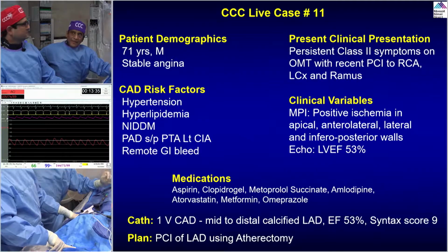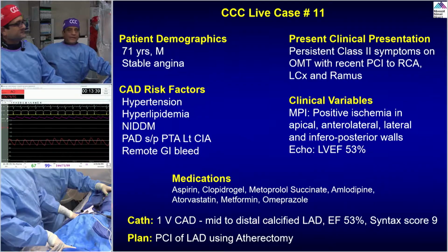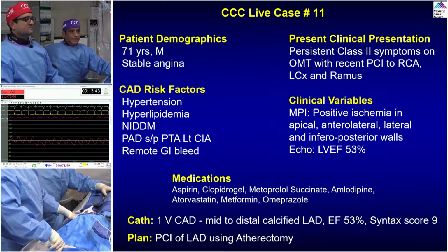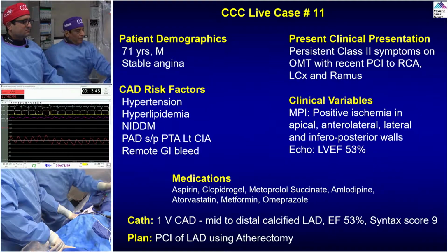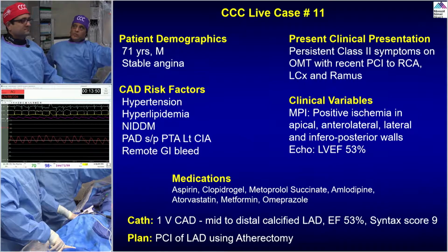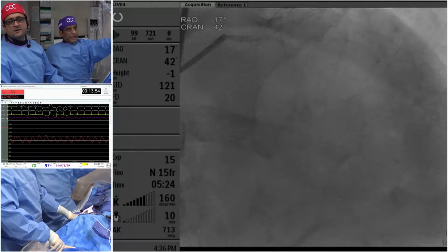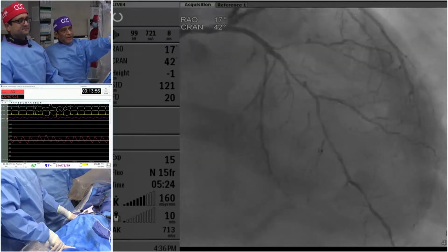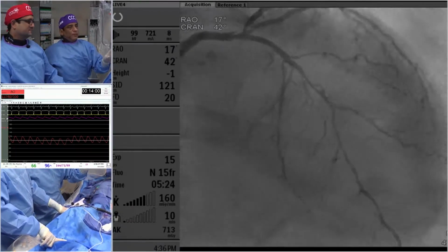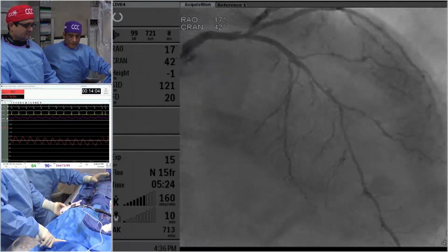There is always a little ulcer in the distal left main. We'll do the IVUS in the end to see what that is. You see the little distal lesion at the 12 o'clock position. But look at the diffusely diseased LAD now. You say, well, maybe it's a very small vessel. But look at the apex. It's almost a 2.5 millimeter vessel. Although it looks like 1.5, there are a few branches. From the calcium point of view, I would call it a moderate calcium, not a severe calcium, which is the tram tract.